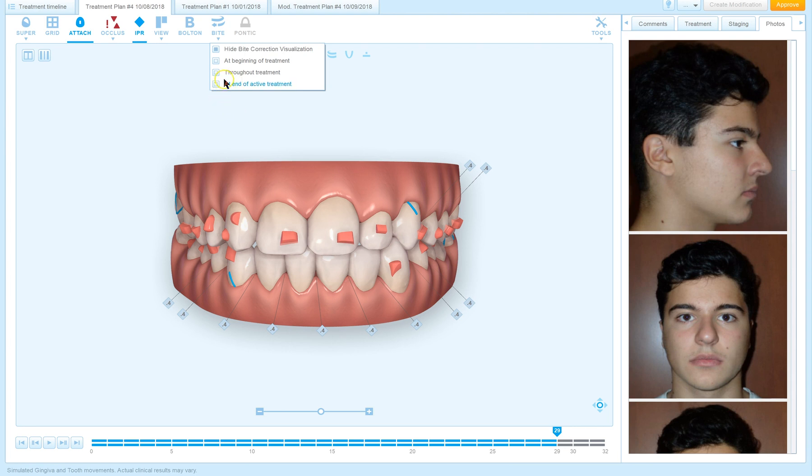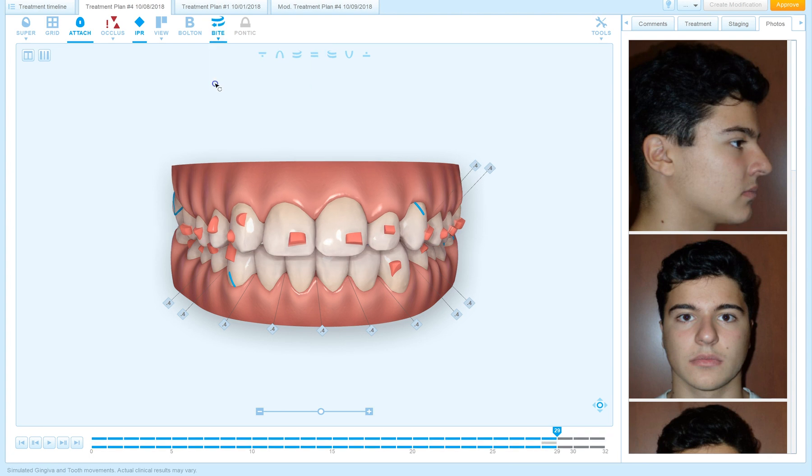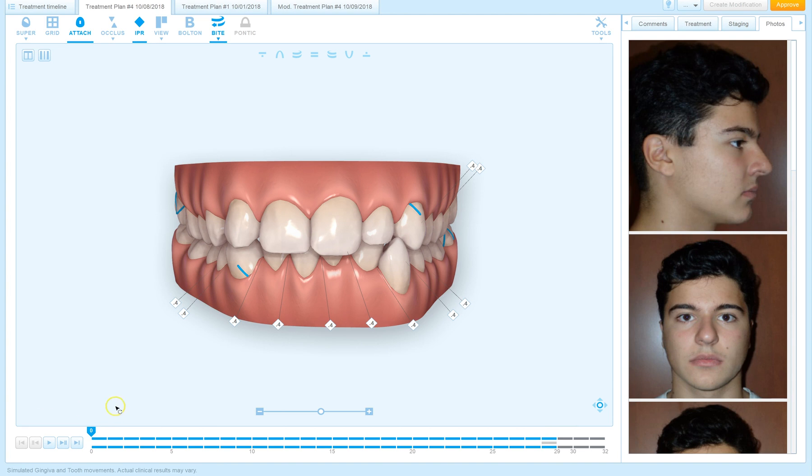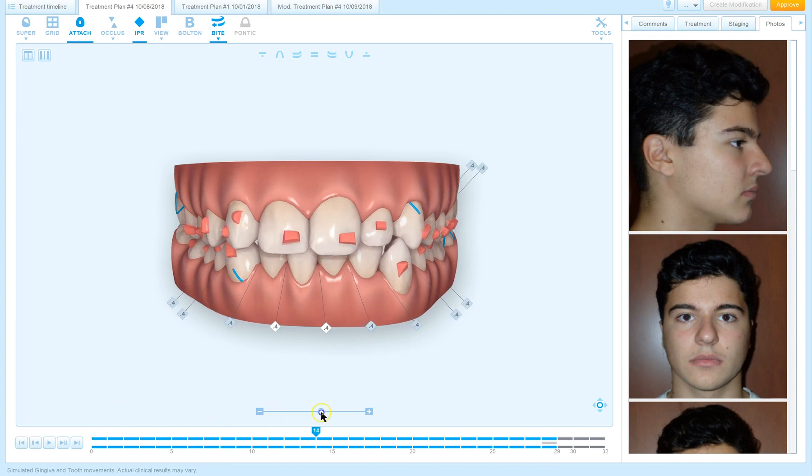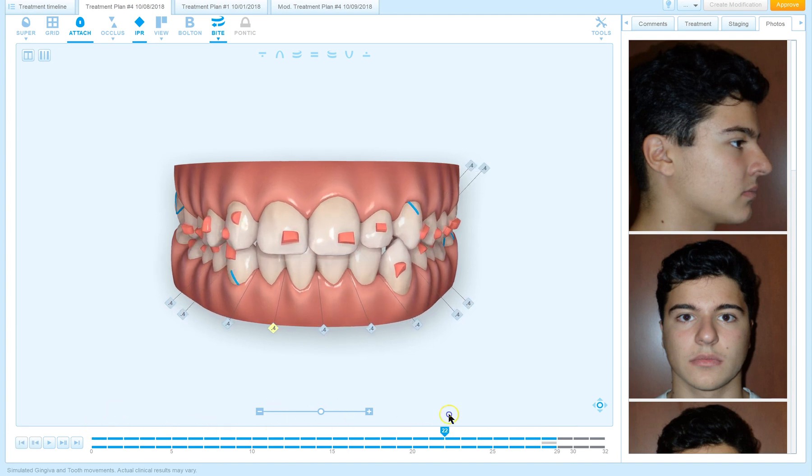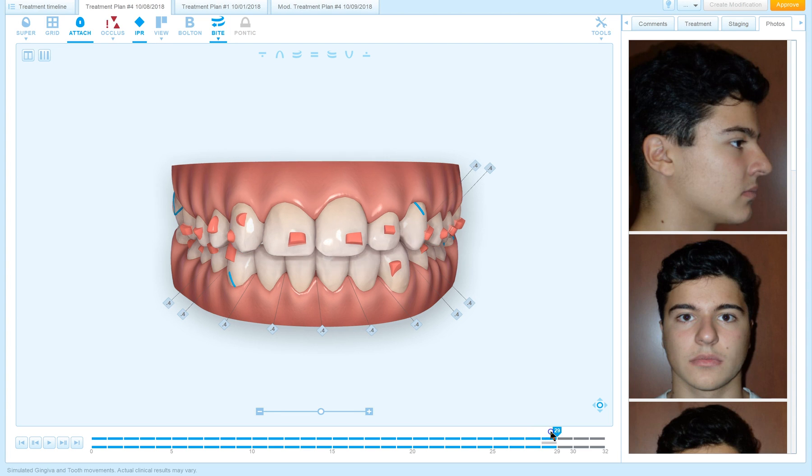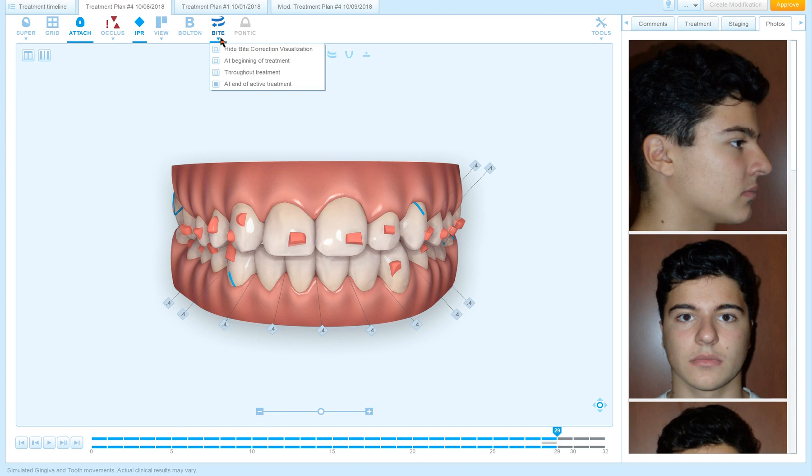It's really just changing what you see visually on the screen as to whether the patient will wear elastics or not. Let's say I put the bite jump at the end of treatment. Now this gray bar is over here. Now whether this bite jump is because the patient doesn't wear aligner elastics, they get to stage 28, they say sorry I couldn't wear elastics, so now I send him for jaw surgery to move his maxilla to the right place. Let's say the patient makes that decision, I could order the ClinCheck the way it is now, I'm ready to approve.